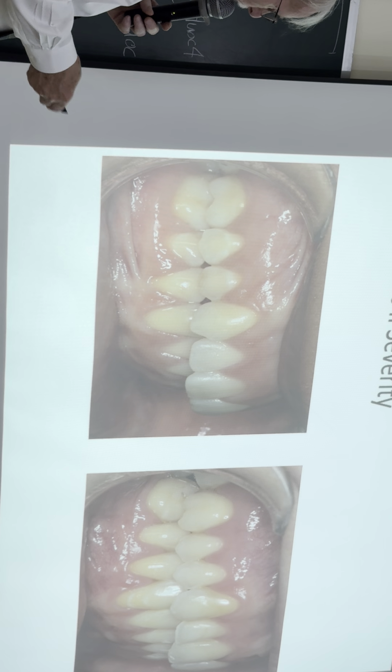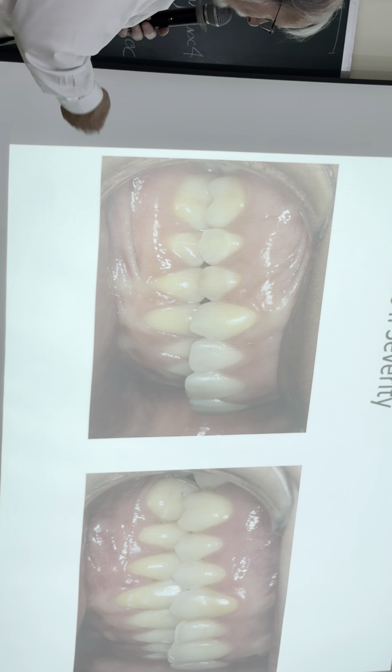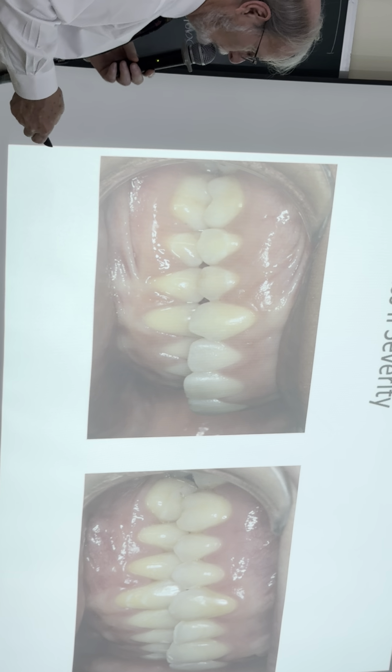This is done with aligners, class 2 mechanics, simple, a little bit of distalization at the beginning, class 2 elastics, and this is very simple to finish.